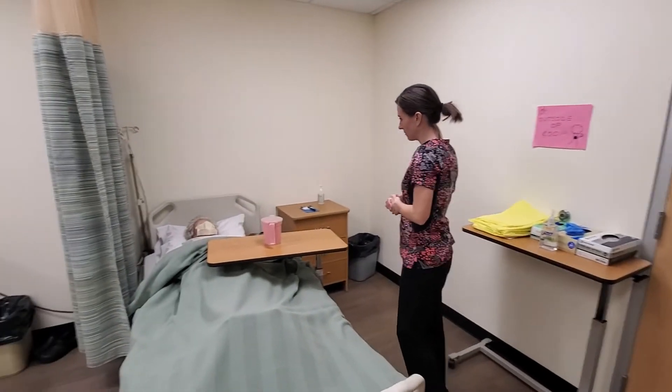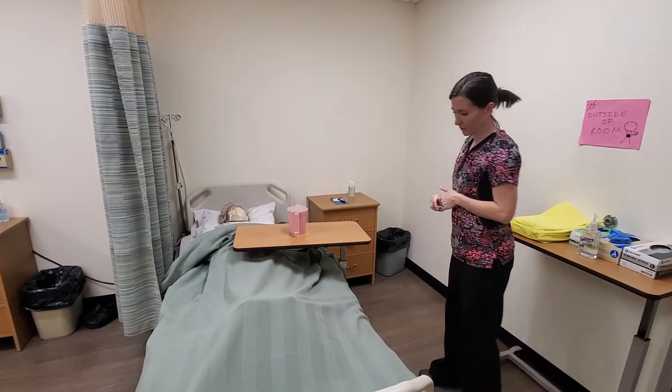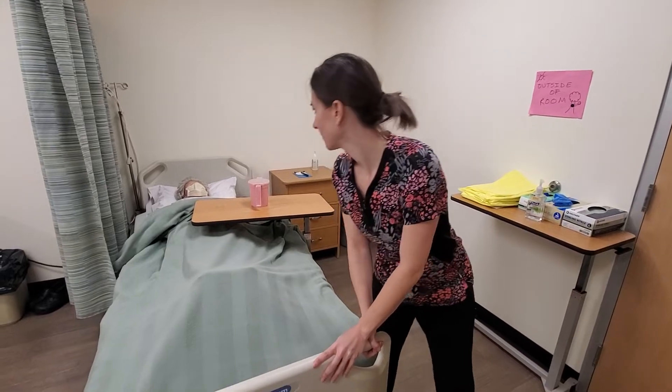Hi Mrs. Perry, my name is Ashley. I'm going to be your nursing assistant today. We're going to do some perineal care and measure your output. I'm just going to check your bed brakes to make sure they're nice and locked for safety.